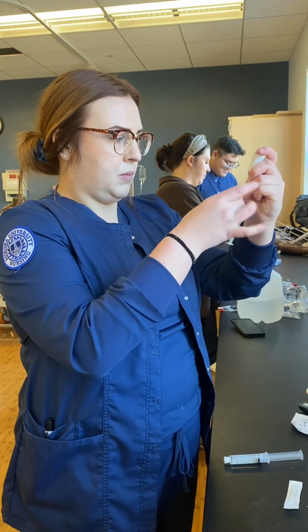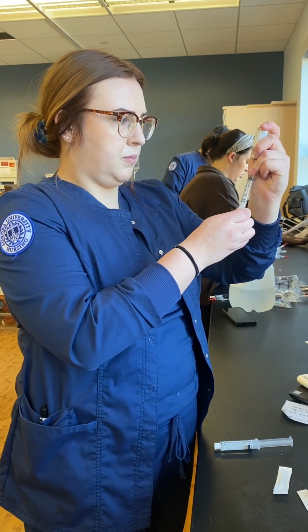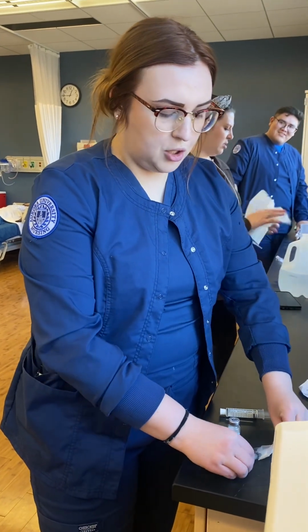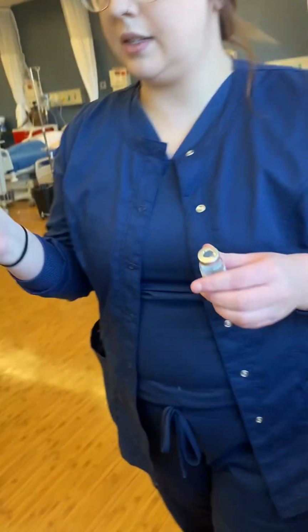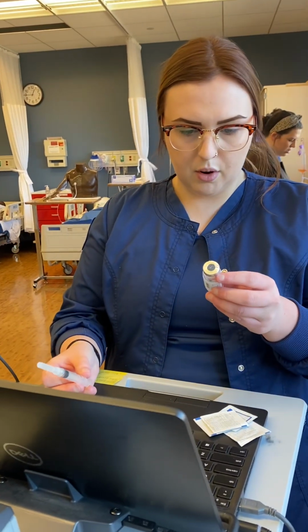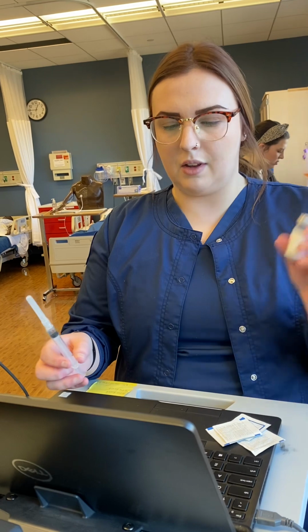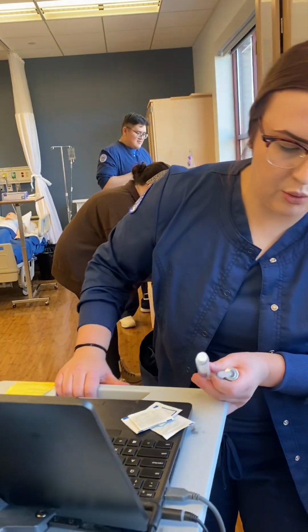Get out any bubbles. Perfect. And then recap using the scoop method. So now I have my medicine drawn up. I want to do my second med check before I leave the med room. 1 milliliter of furosemide, which is 100 milligrams in 10 milliliters. So I have 1 milliliter, 10 milligrams of my medication. So now I'm ready to go to my patient's room.